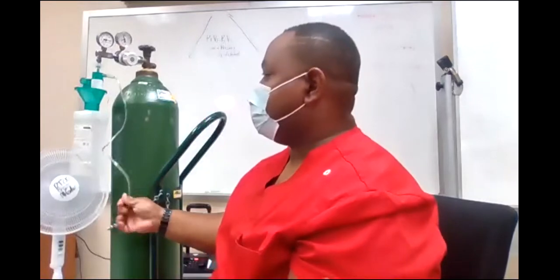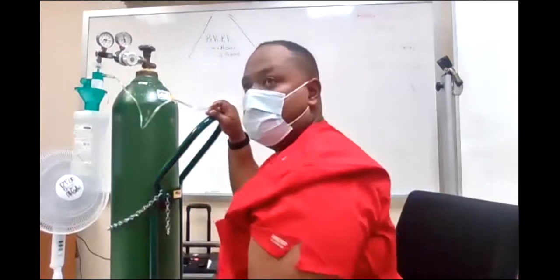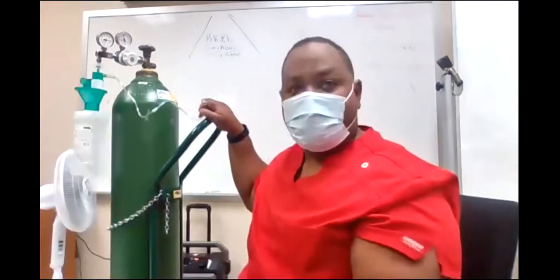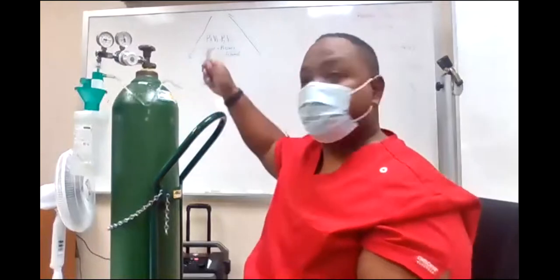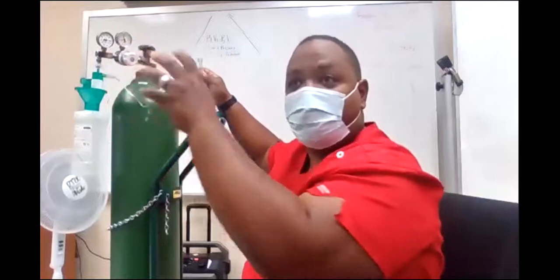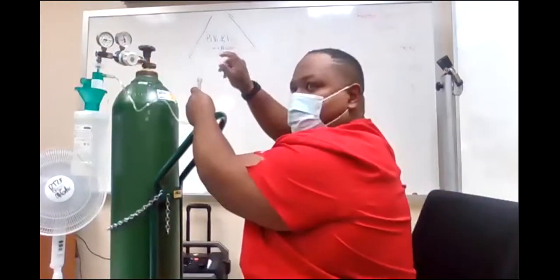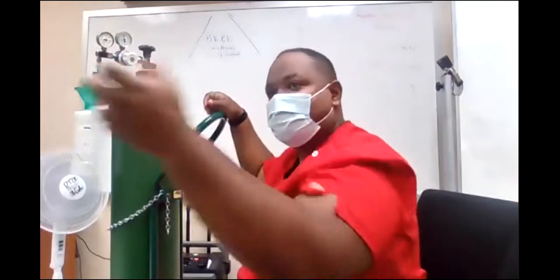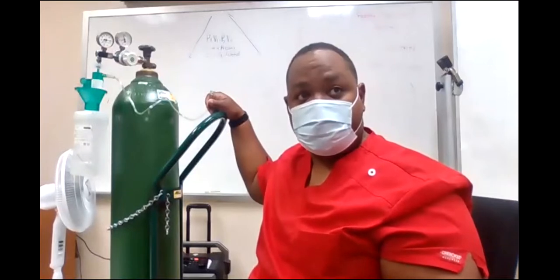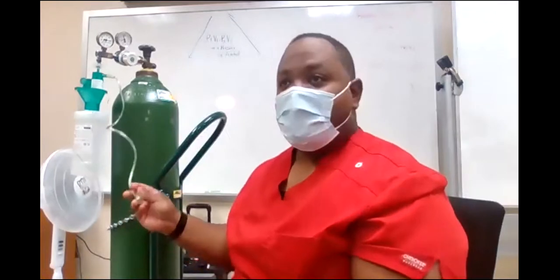Now, this is what this one is for. This is the little side port. If I want to bleed this oxygen percentage down, this side port will hook up to the air, a yellow flow meter, the one that's usually right next to each other on the wall. I would screw this one up to the yellow one, and turn the yellow one up until the FiO2 percentage goes down to what I want. Got it? That's why sometimes we use these.